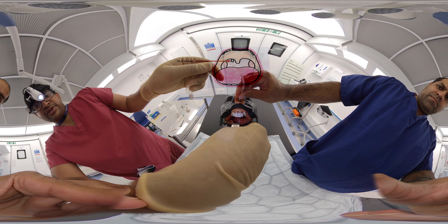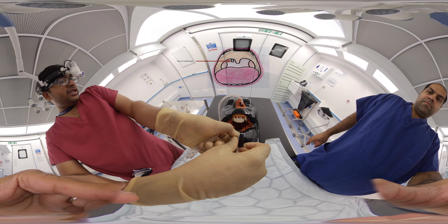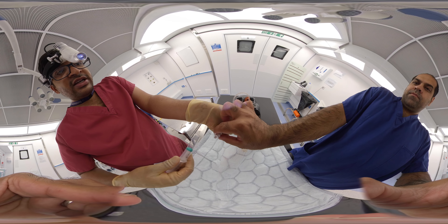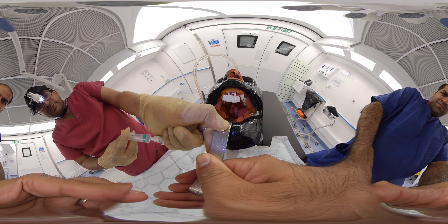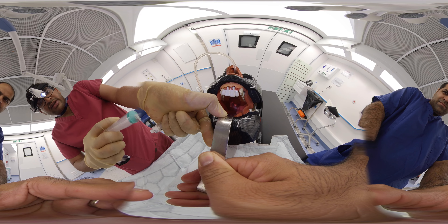Once we can see the bulb of the Foley catheter, we should slowly inflate it — at least 15 ml. We should be very careful. Here we are inflating the balloon, which gives pressure in the posterior nasal pharynx.